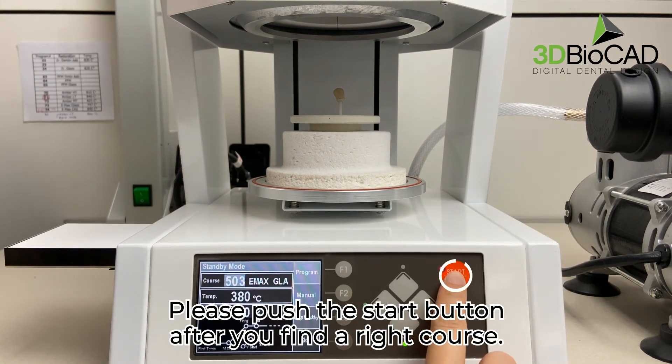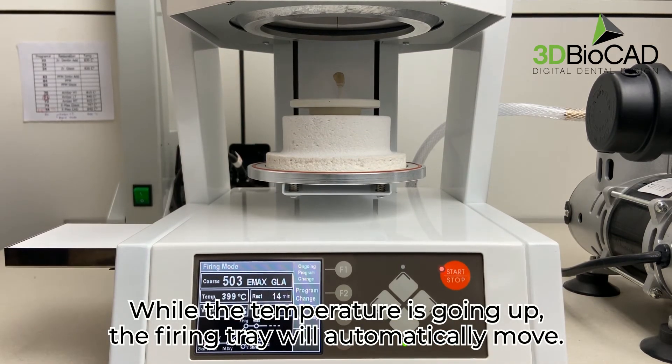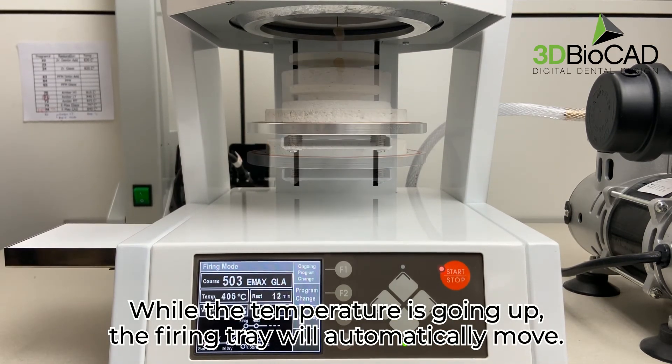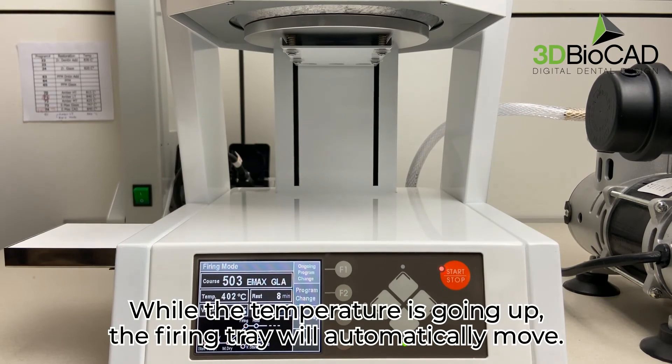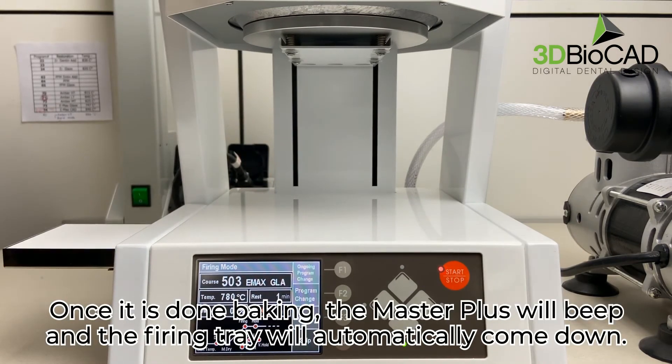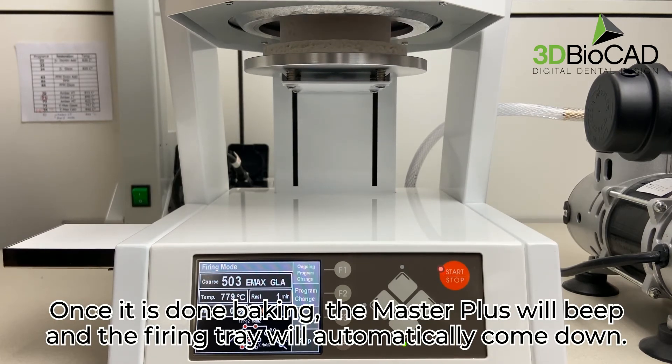Please push the start button after you find the right course. While the temperature is going up, the firing tray will automatically move. Once it is done baking, the Master Plus will beep and the firing tray will automatically come down.